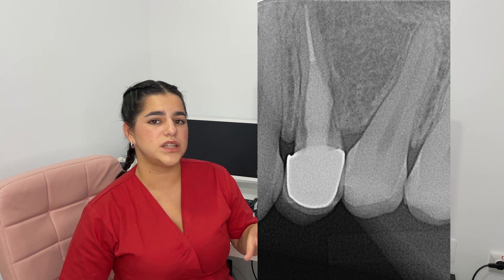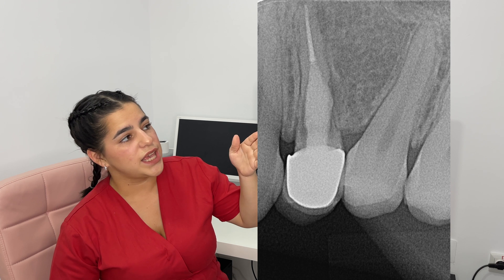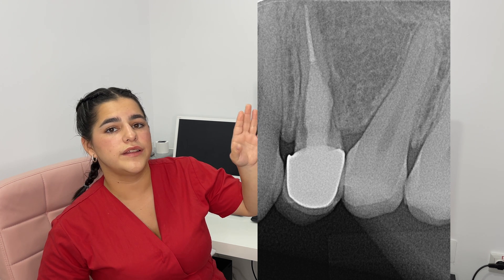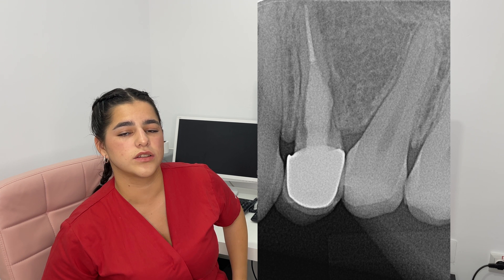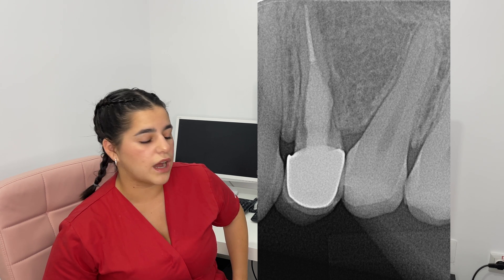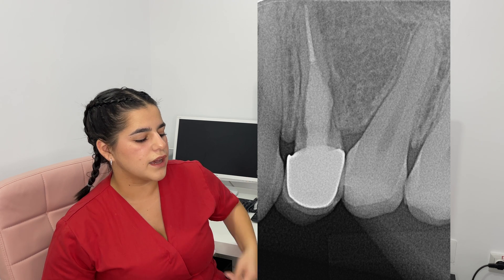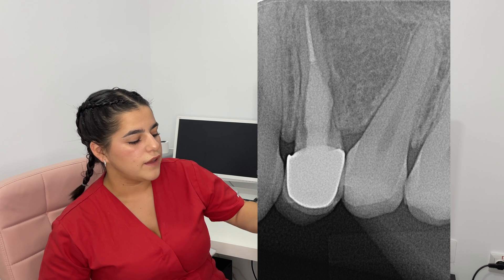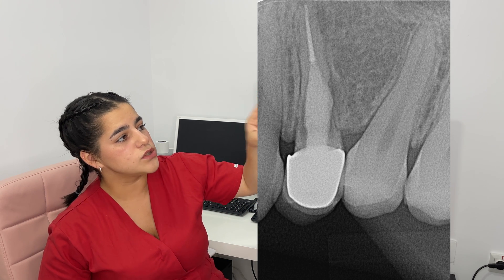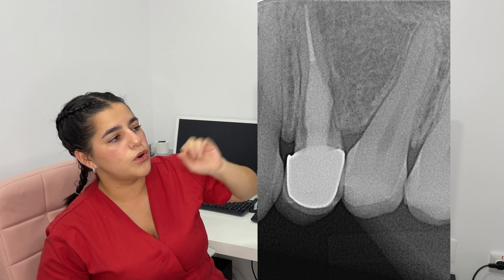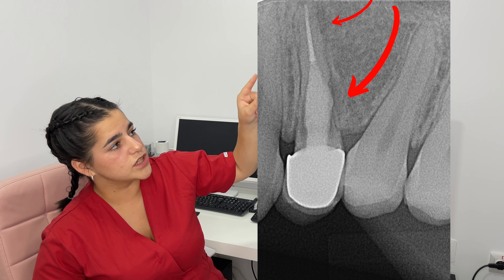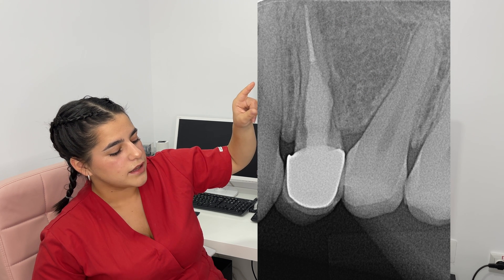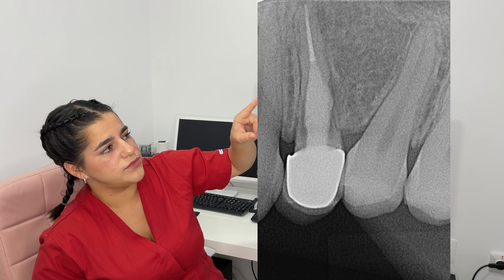However, in this case, the patient is 20 years old and on her first premolar she has a post and core that was not placed properly — it perforated the root on the distal side, resulting in a lot of pain, just two months after the procedure. Our doctor told us that the patient needs the tooth extracted and an implant placed, because attempting to remove the post and core will likely fracture the tooth. You can see the translucency of the inflammation next to the post and core where it broke the root, with inflammation along that side and even a periapical inflammation — unlike the neighboring teeth which look completely normal.